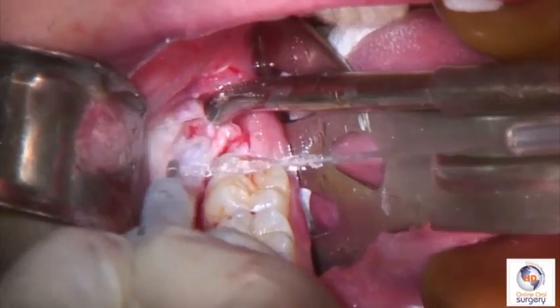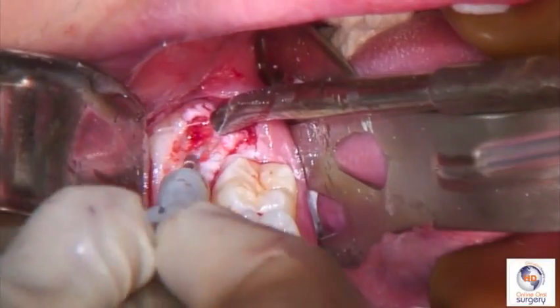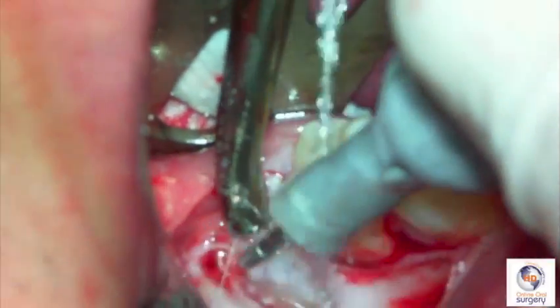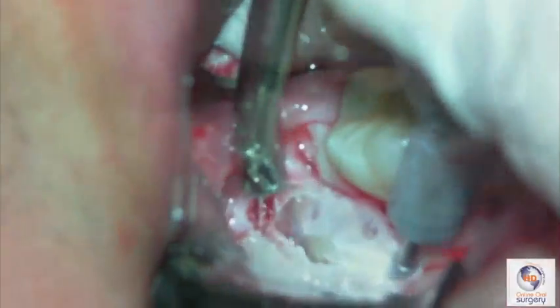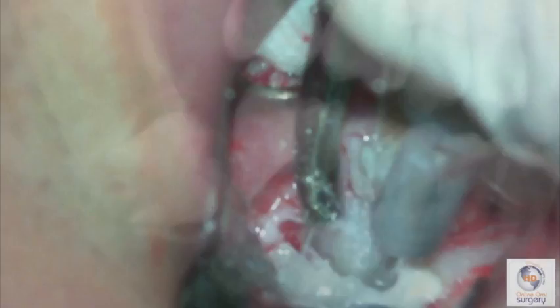As I start sweeping away the bone, I will begin to see the tooth, and that will help me as far as where I'm going to be further removing the bone. I'm using a very light stroke, a very light pressure, and once I've found the margins or the border of the crown, I'm going to be sweeping away bone, as you can see there, on the buccal aspect and a little bit onto the mesial, basically creating what we call a trough.